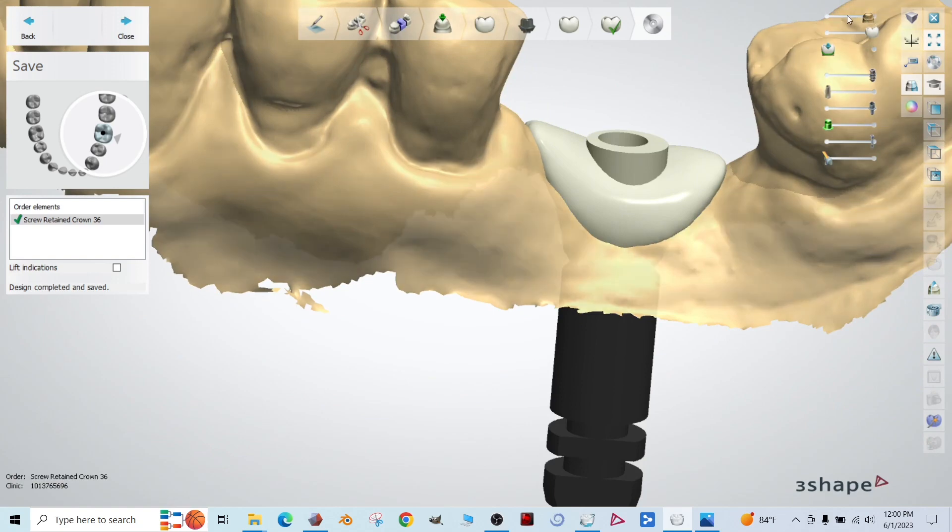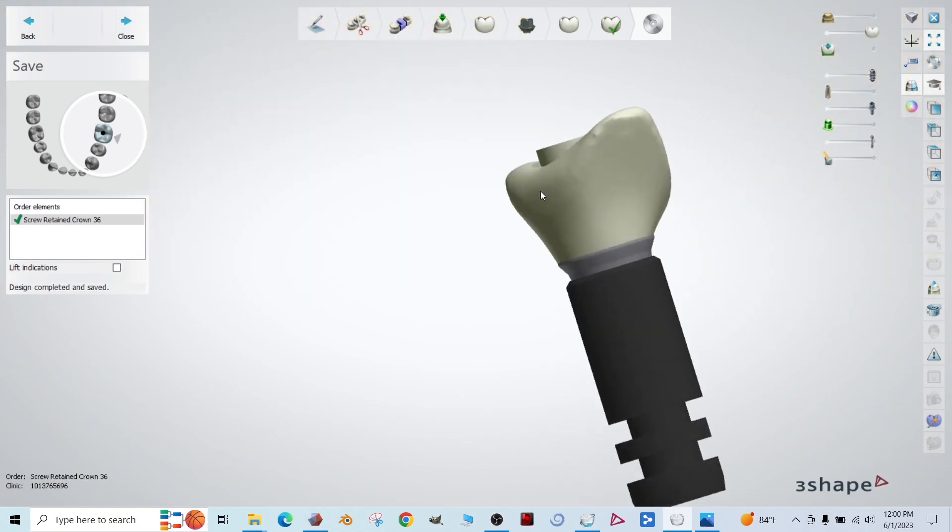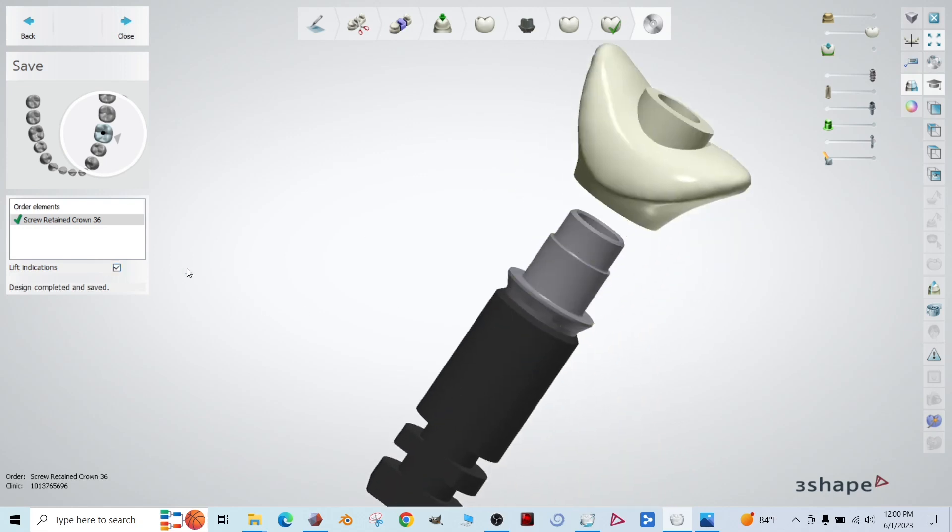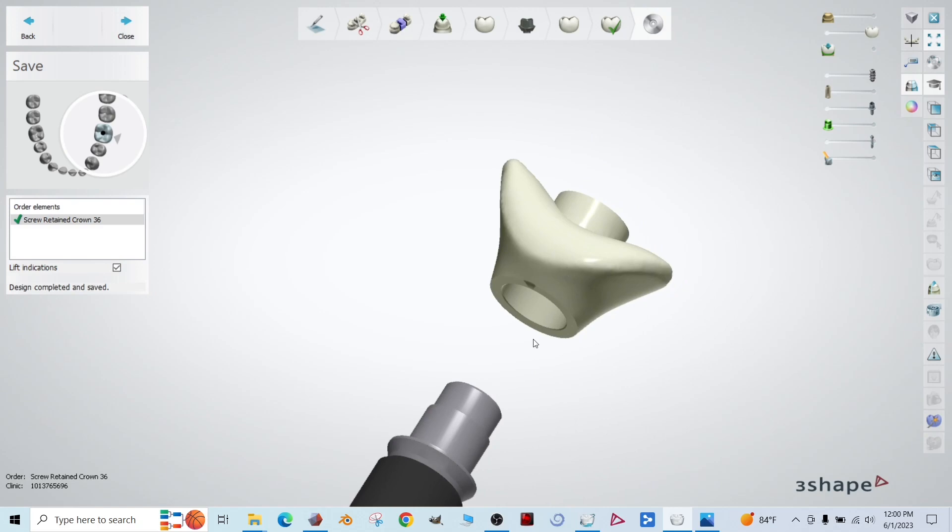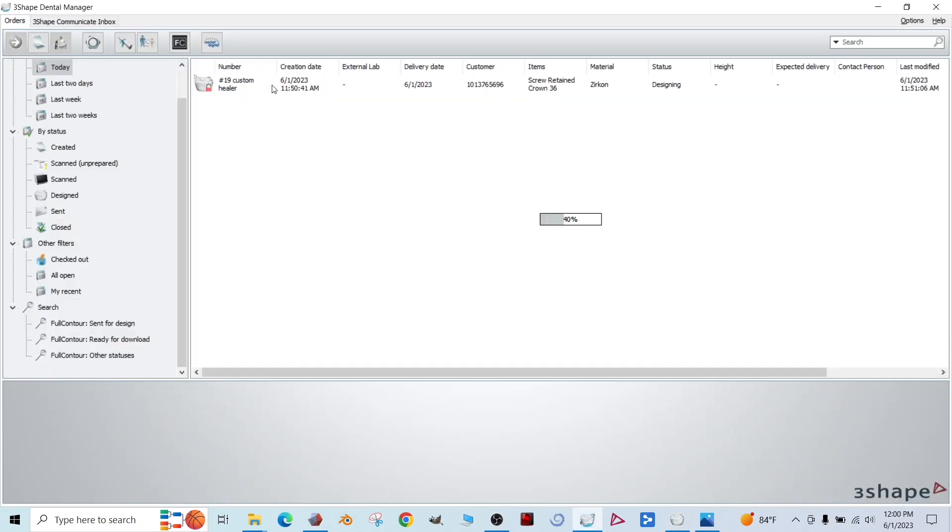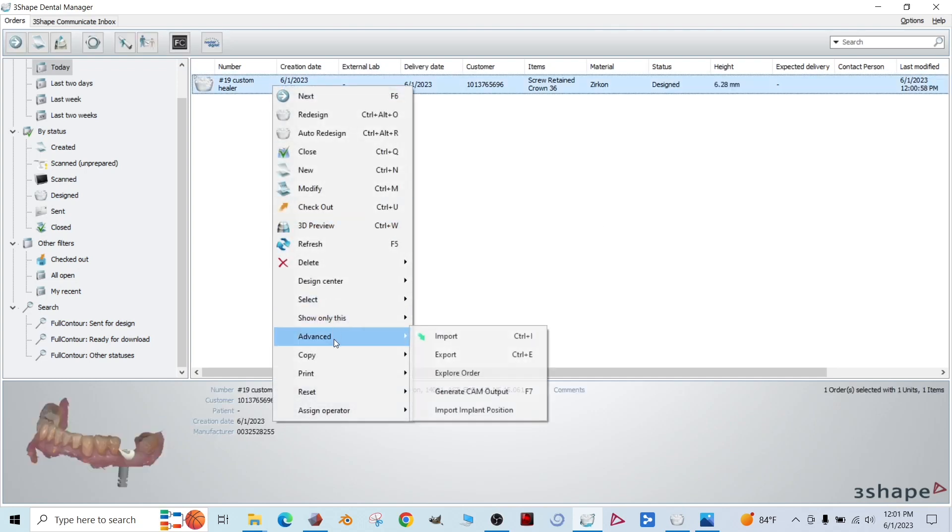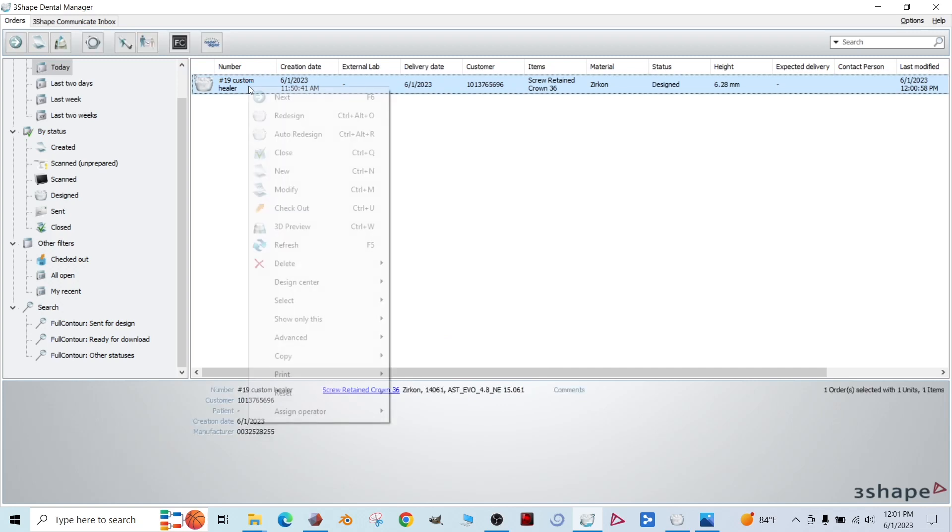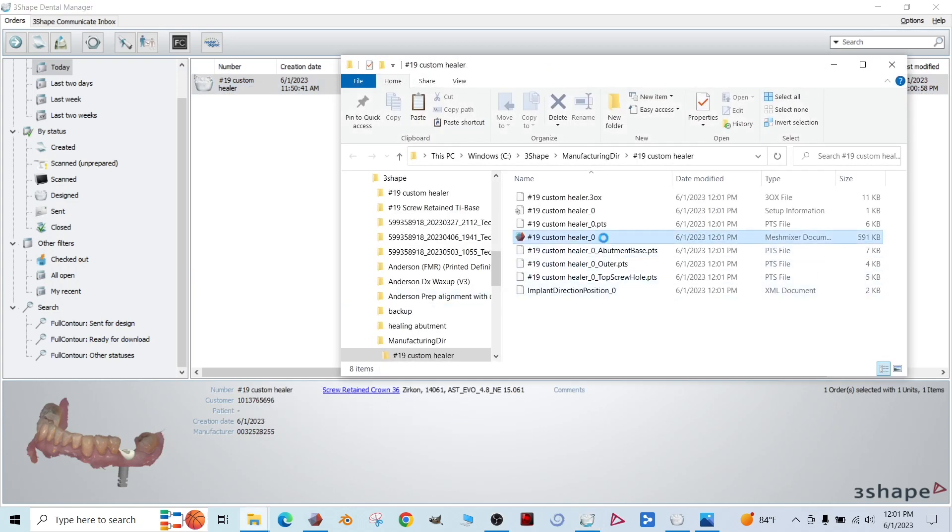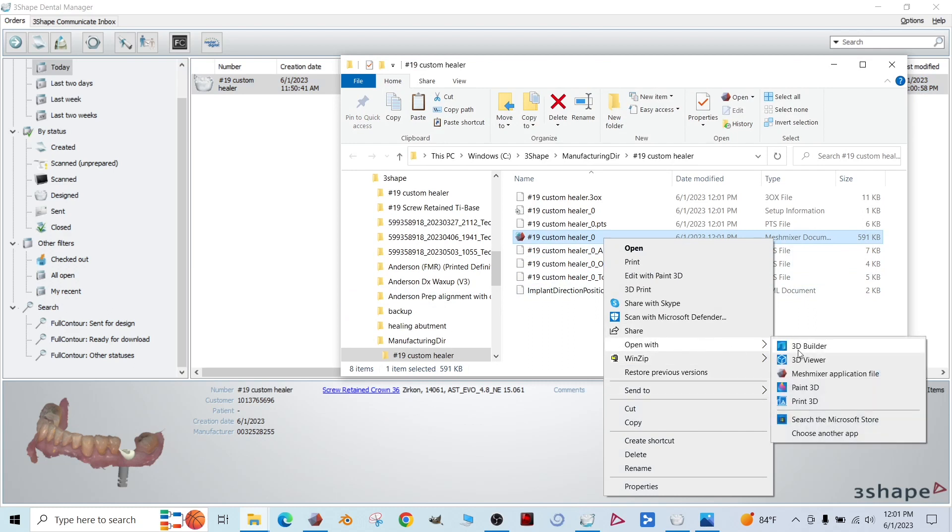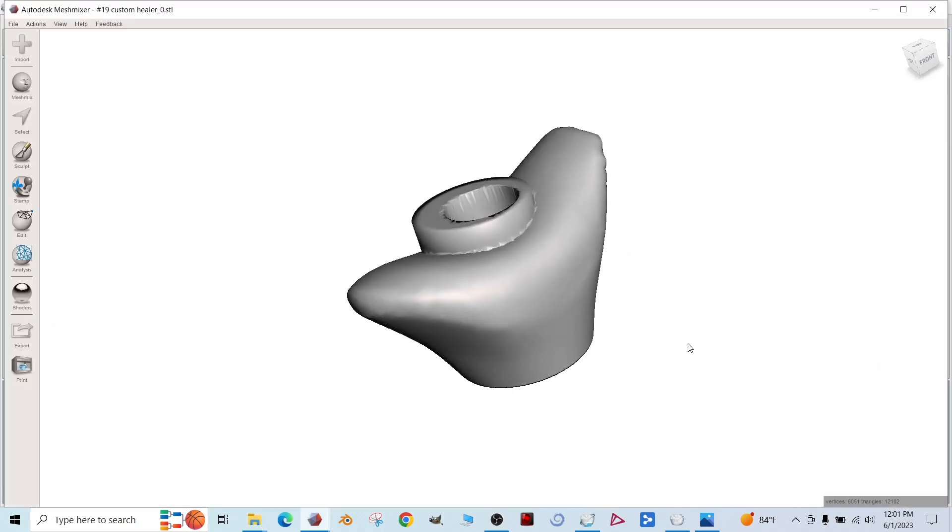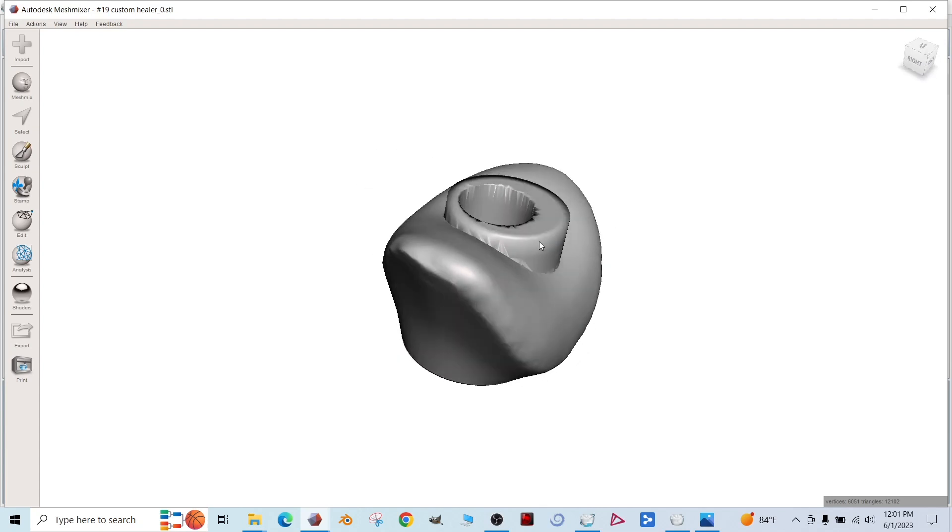And there we go. So now we have our custom healing abutment. Needs just a little bit of modification after the fact. And then we'll bond that to our non-engaging tie base. Go ahead, click close to access the output files. You need to go to advanced generate cam output. And then right click the case again, advanced explore cam. And then we have our custom healer here. Now let's just open it with mesh mixer. Just so you can see it. There we go.